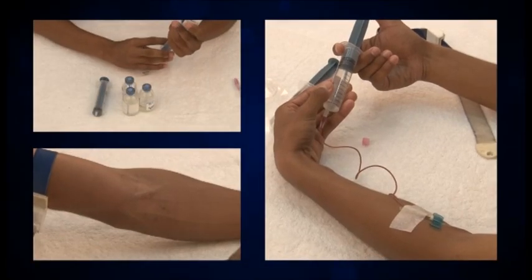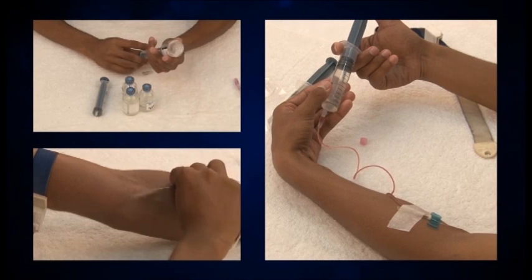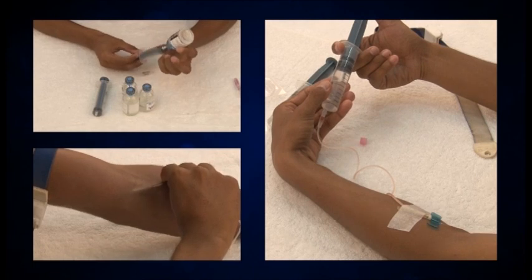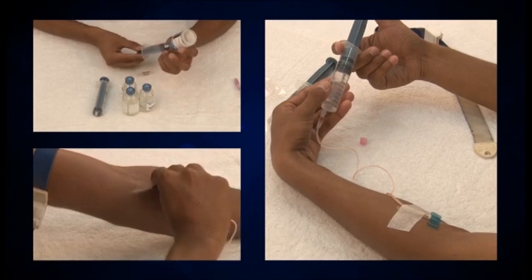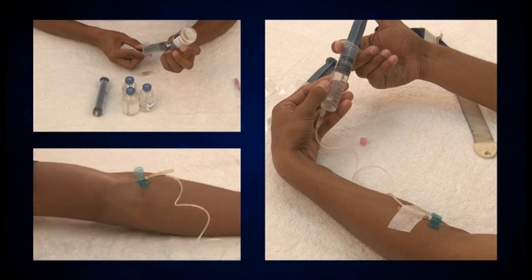Self-infusion of factors is a simple process which can be done easily at home. Let's have a look at one such patient who has made it a part of his routine. He can infuse the factor on his own with ease without being dependent on anyone.